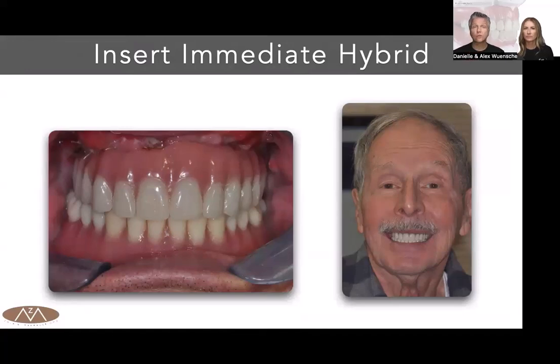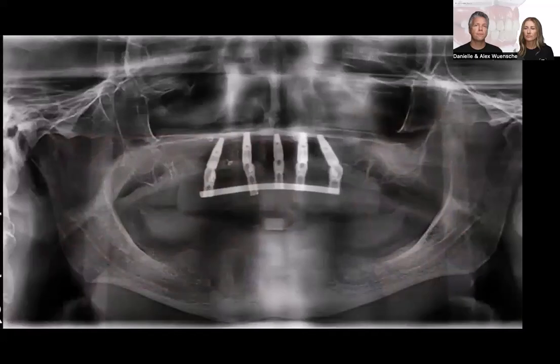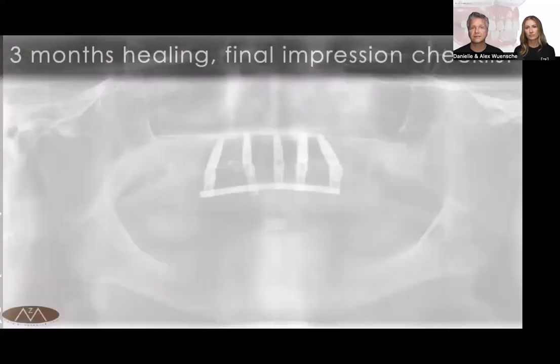That was day of surgery or delayed, either or, it doesn't matter, right? So it's the same result. After the healing phase, the patient will have a fixed hybrid basically. Here we see a little strengthener, reinforcement, and we see 5 implants.